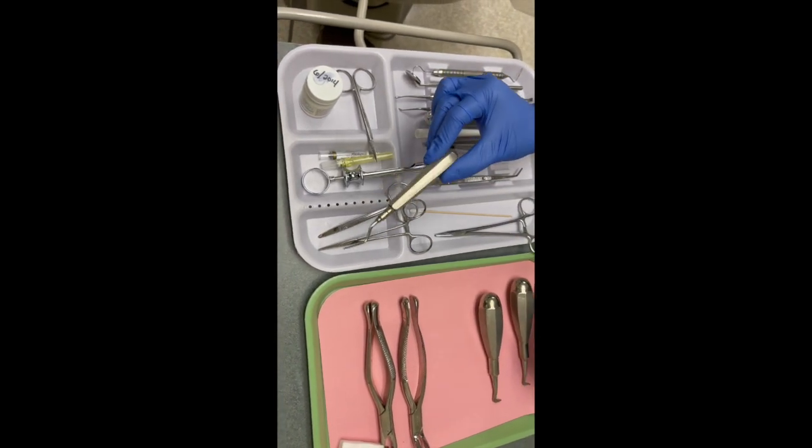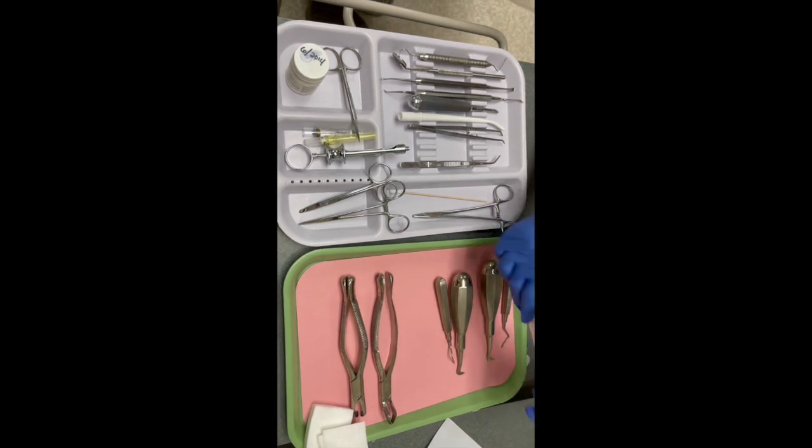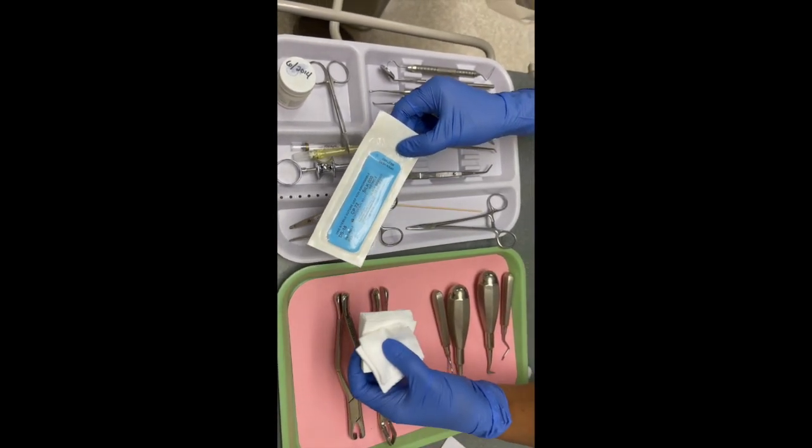Then you have your root tip elevator to lift and remove fragments from the root — it's just like a single edge. You have your suture packet and 2x2 gauze, and that is a simple extraction tray.